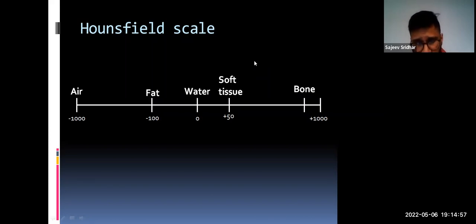Just to give you a quick idea, CSF is not exactly pure water. It is still a little bit denser than water.